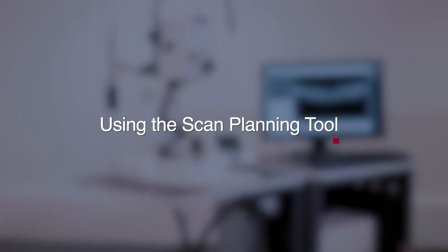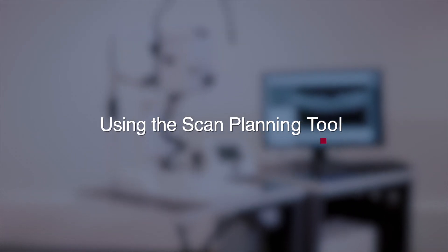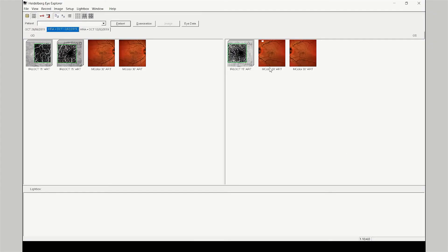Using the scan planning tool. The scan planning tool allows the clinician to define a region of interest using a historical fluorescein, ICG, autofluorescence, or multicolor image, and correlate OCTA data with other imaging modalities.